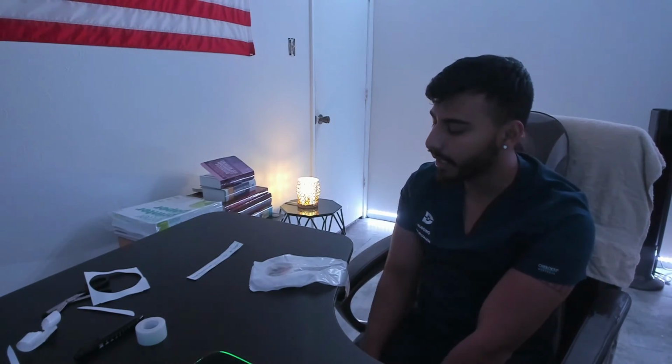Once I feel like the bag doesn't need to be changed and I empty out the contents, I can go ahead and put the bed to its lowest position, rail back up. Well, of course, remove my gloves, perform hand hygiene, put the bed back into supine or a semi-Fowler position, whatever the patient wanted. Assess for additional needs, call light within reach, my expected time to return, document the date, the time, the assessment, and the patient's response to the procedure.